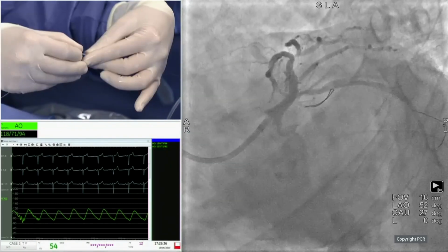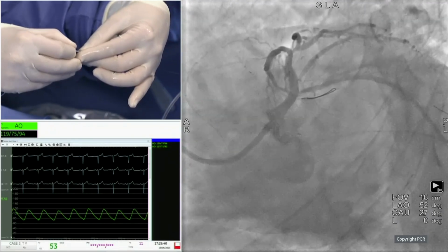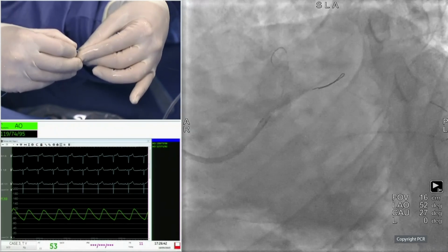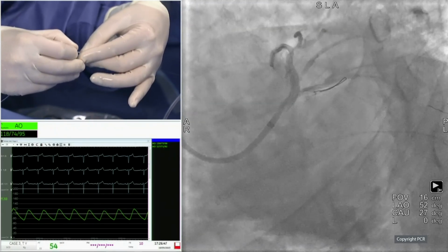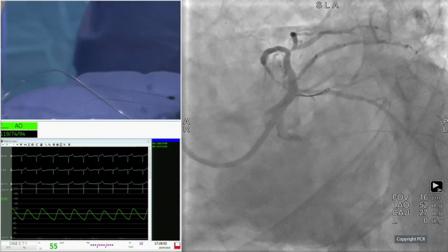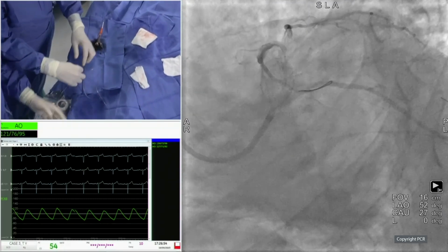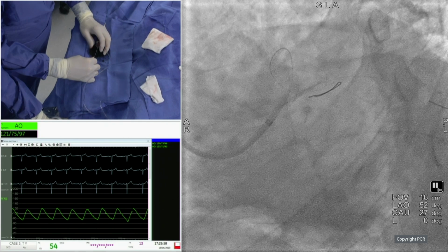I really learned something today, yeah? We could also do a QFR. Yeah. So in many cases where we did the IVL on the pressure wire, especially in the LAD, there was no problem. But then when the pressure wire was in the side branch and we were doing IVL, the pressure wire sensors would just go away and no tracing could be found. Okay.